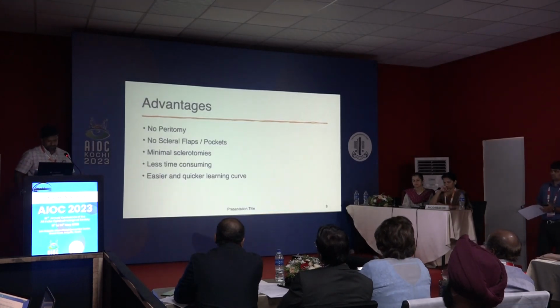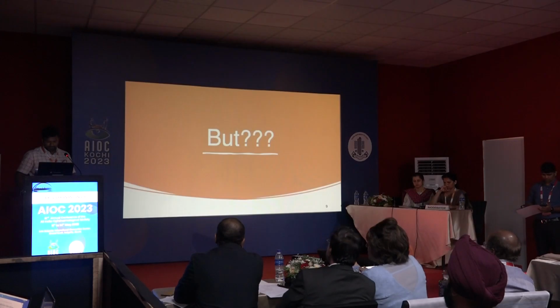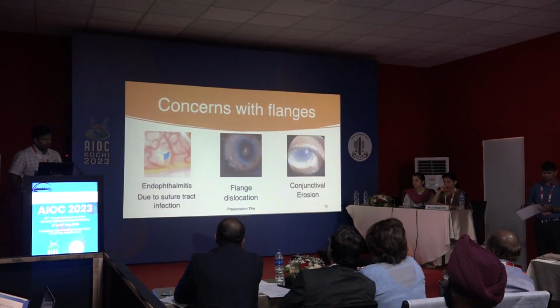So the advantages of these flanges are no peritomy, no flaps, minimal sclerotomies, less time consuming, and the learning curve is much easier. But this is what I mainly wanted to discuss.